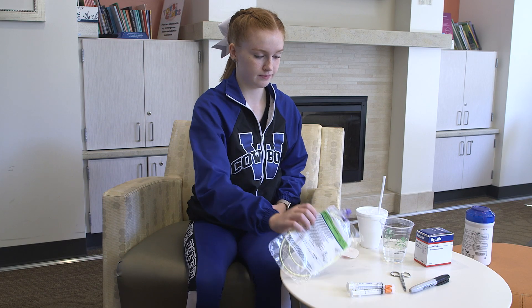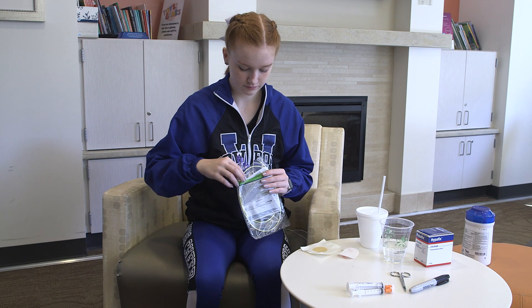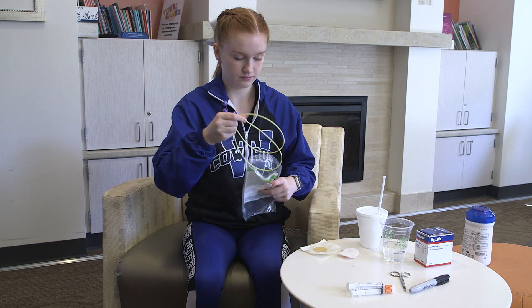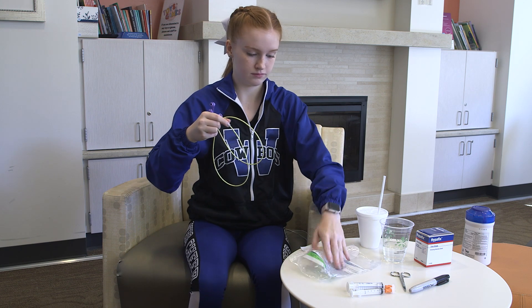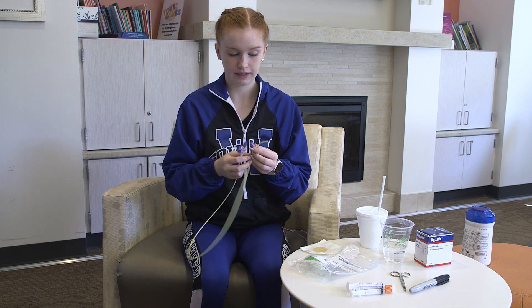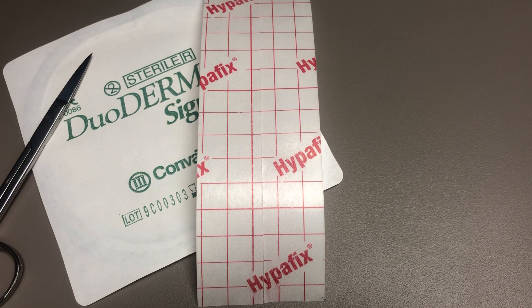Now that you have collected the necessary supplies, you are ready to insert the NG tube. If there is a stylet, pull back to make sure it moves freely so it will be easily removed, then push it back into place. Cut a piece of duoderm to place on your child's cheek, and also cut a piece of Hypofix to secure the tube once it is placed.